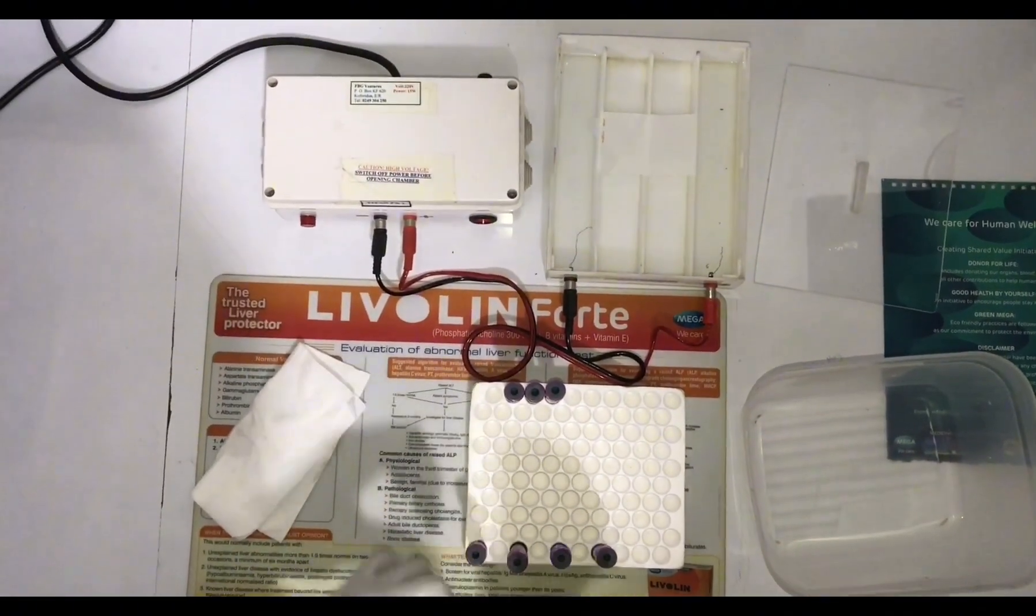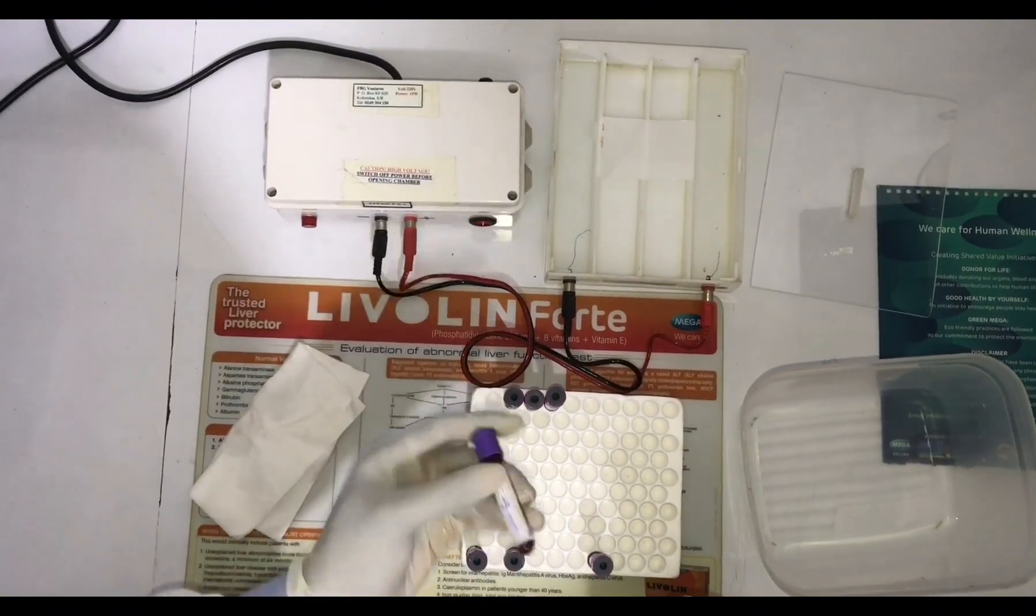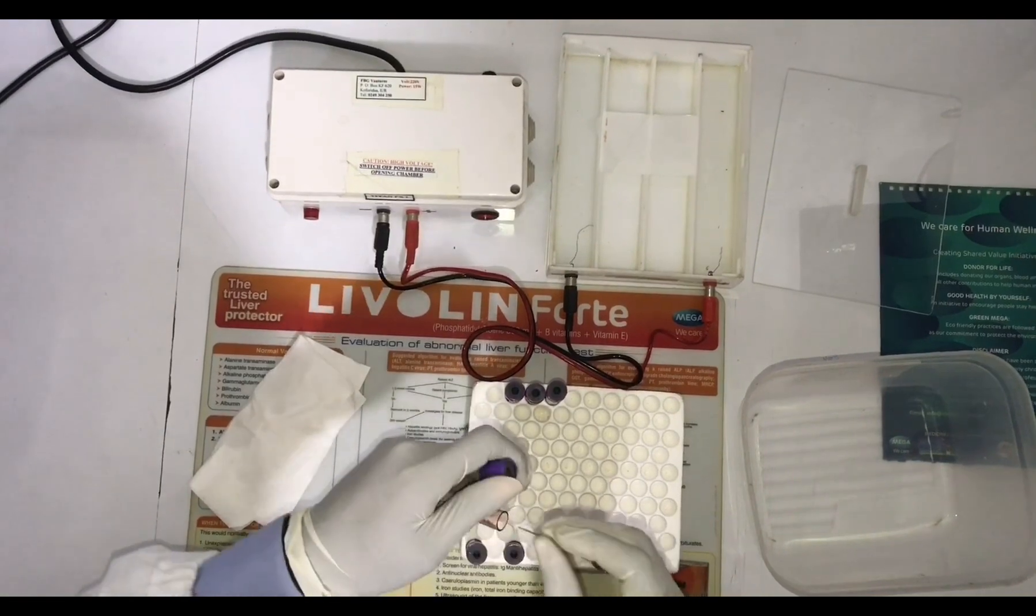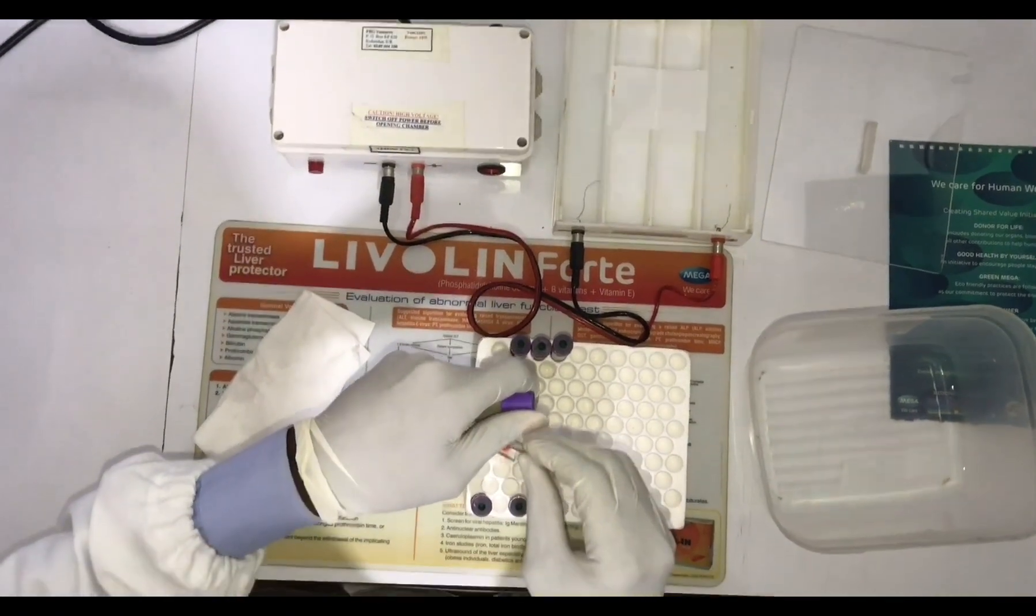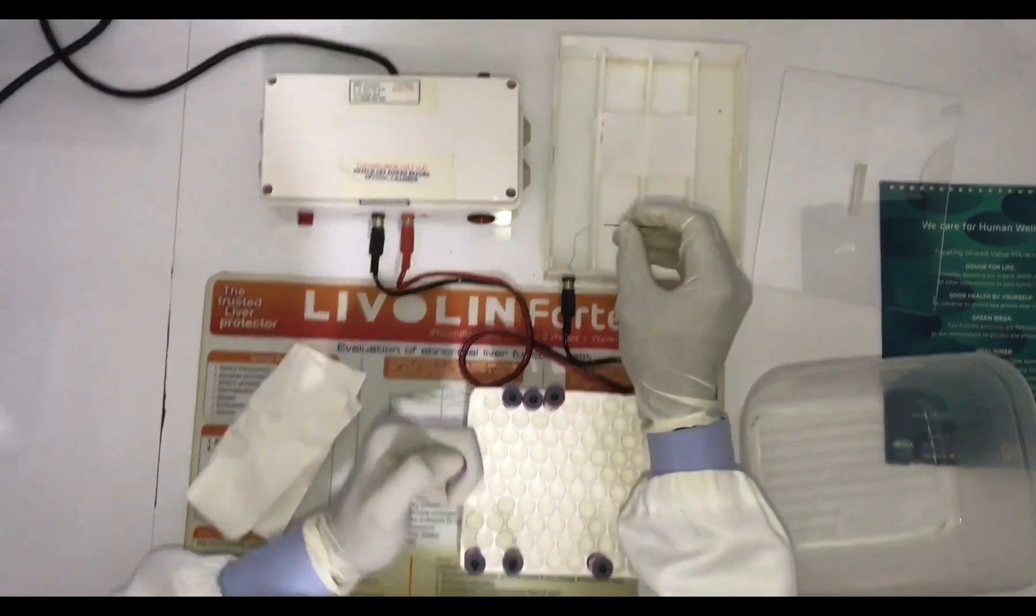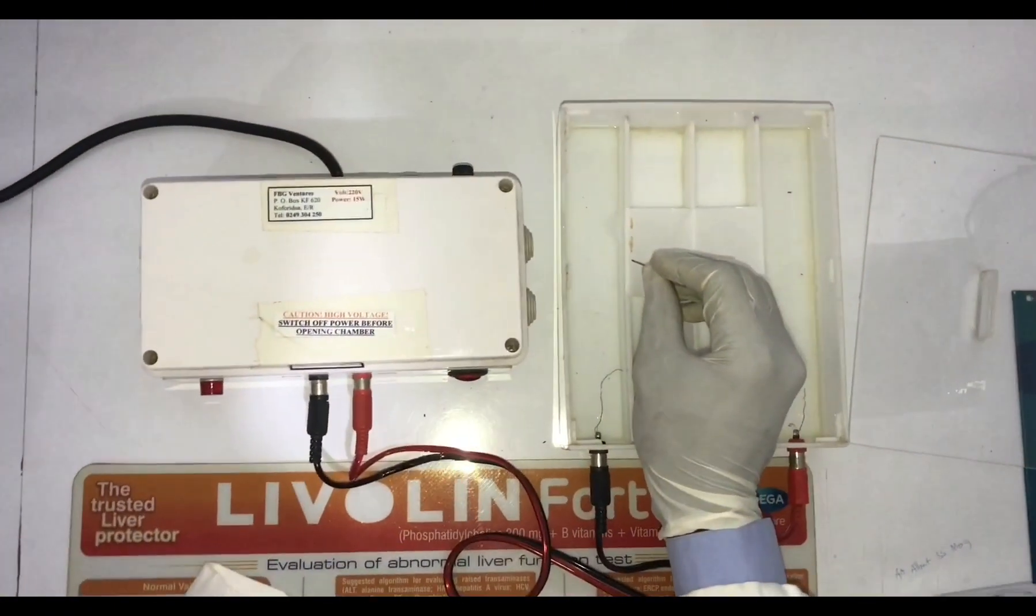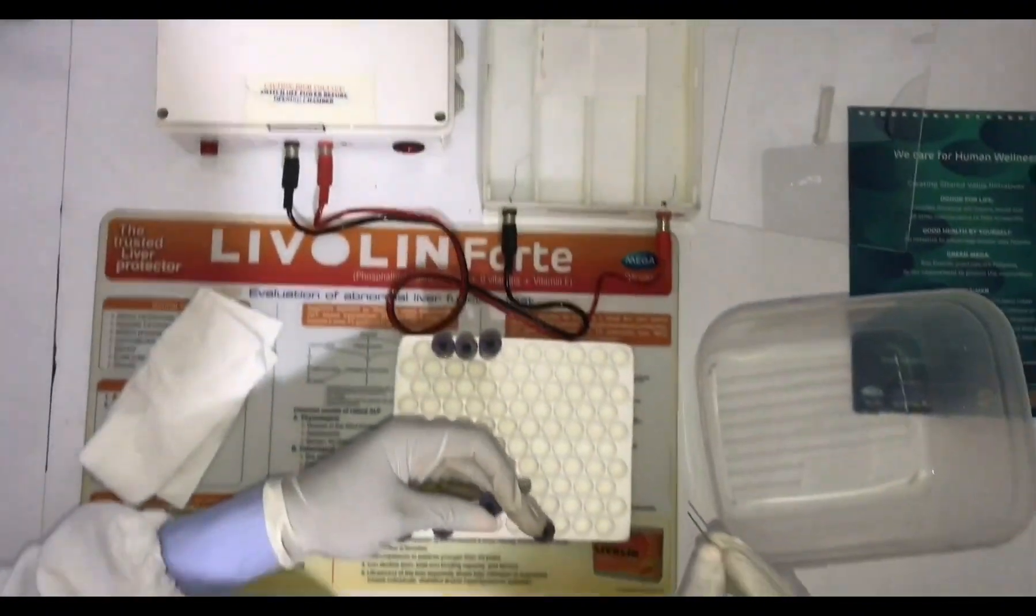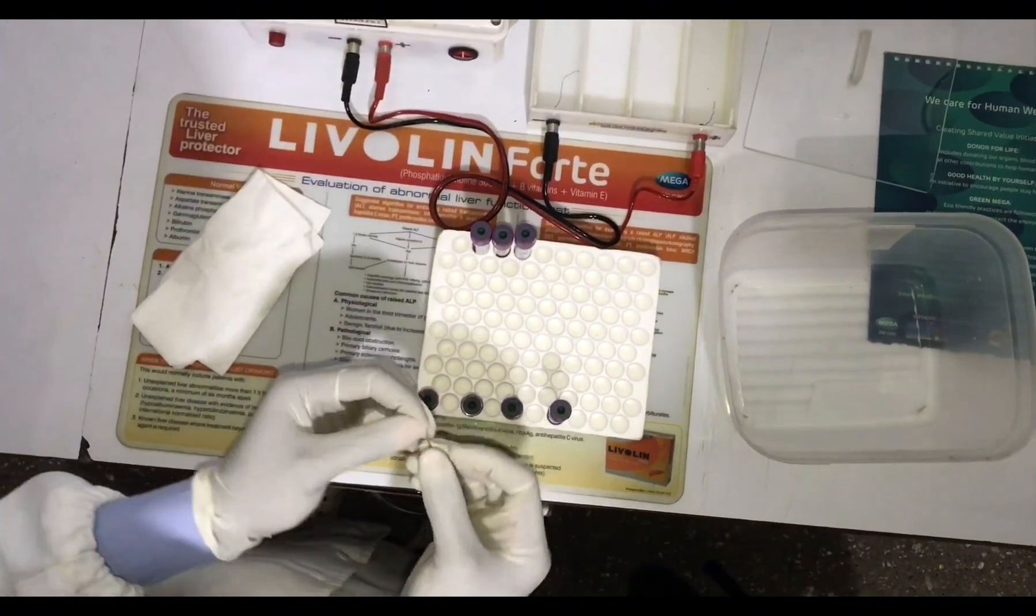From there we are going to take the next control which is the AS control. You dip it in as well, just as we've done for the two samples. You make a line which is literally the third line now on the cellulose acetate paper, and then you cover the sample and put it down.